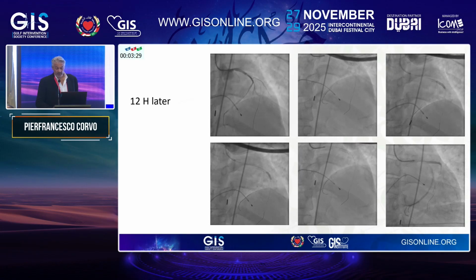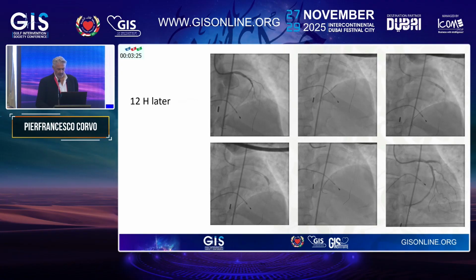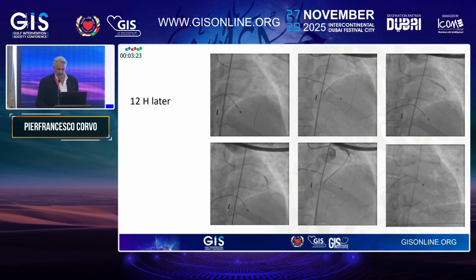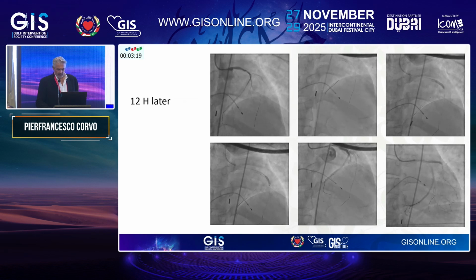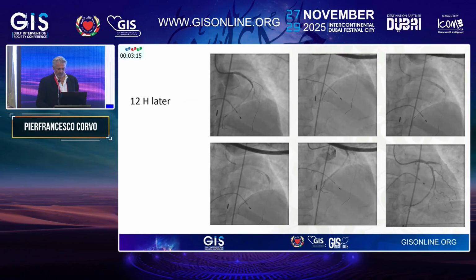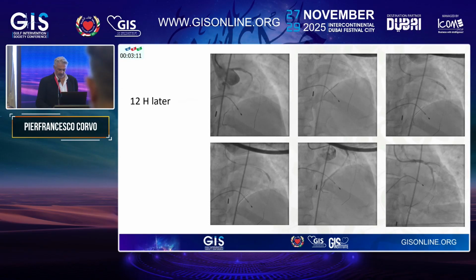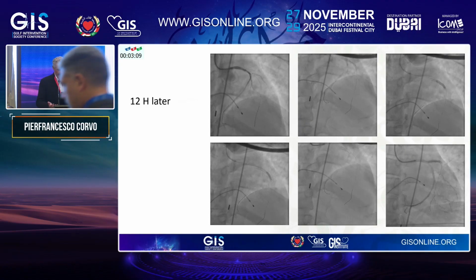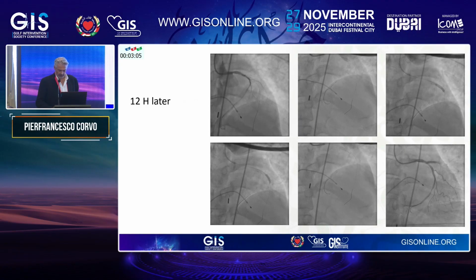The patient maybe was refractory to heparin, but the ACT we checked during the CPR was 250. So again, the operator proceeded with multiple dilatations of the LAD and the left circumflex. Every time there was good flow in the LAD, there was occlusion of the left circumflex.